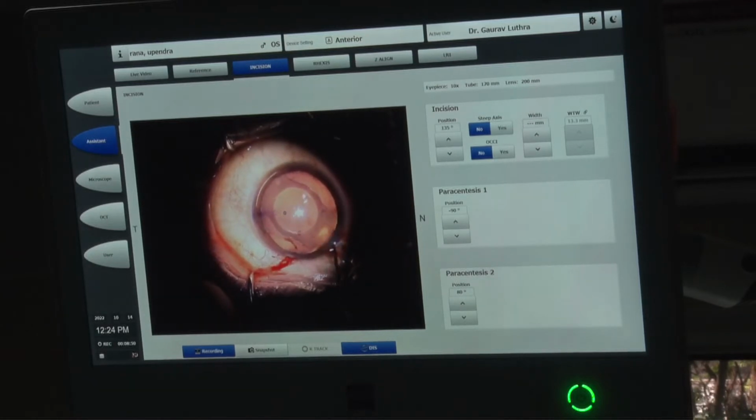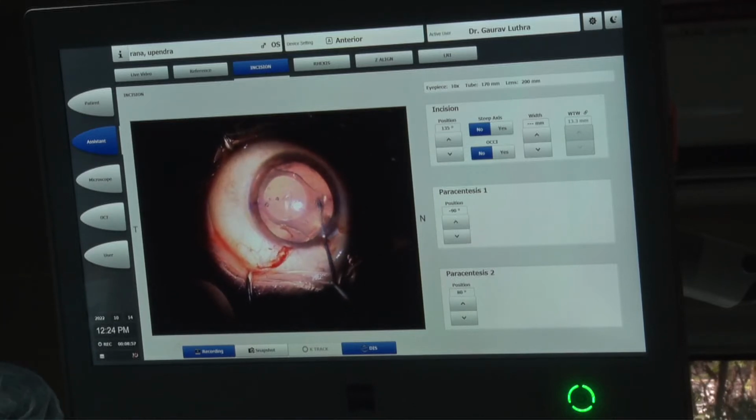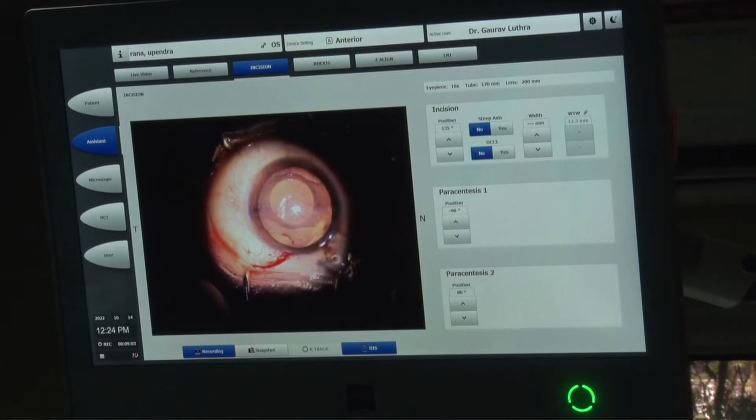These 3 landmarks tell you whether your ICL is opening in the correct size. There are 3 ways to actually tell, and then this small hole over here, one is a pear-shaped one, and the other one. So you have to learn to see your landmarks well, because when you're injecting, they will all tell you whether you are opening up in the correct way.